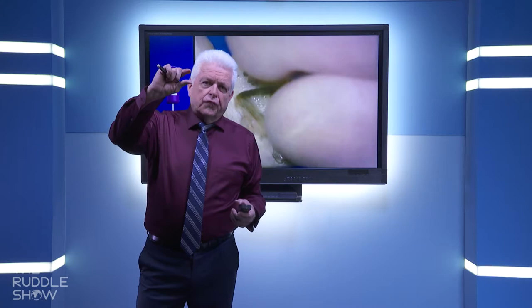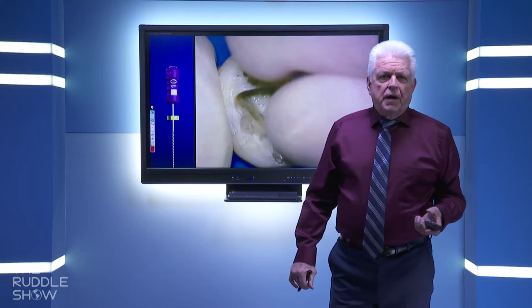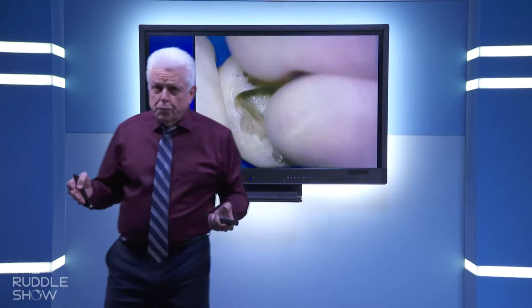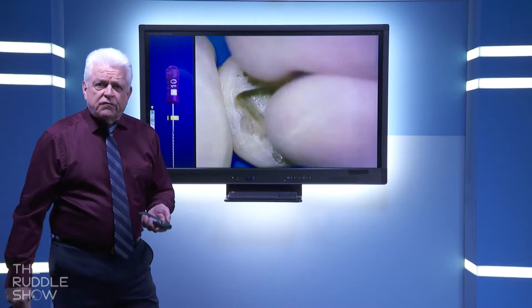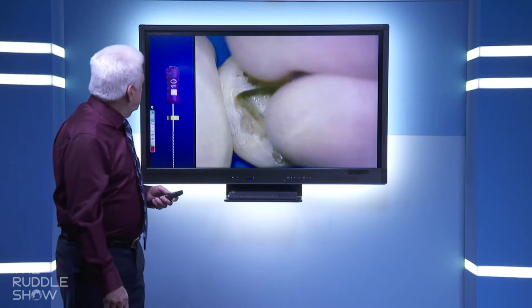I presented this many years ago at the Chicago Midwinter Meeting. Phyllis and I were at the University of Illinois, about 20 or 30 miles away, and they used the Super Bowl truck, literally, that they used for the Super Bowl, to beam our signal to the McCormick Center, where there was a core audience of about 750 people. So I'm explaining to the audience how to remove a sectional silver point that's deep in the DB. And we're going to be using some files, and we're going to be using some solvents.